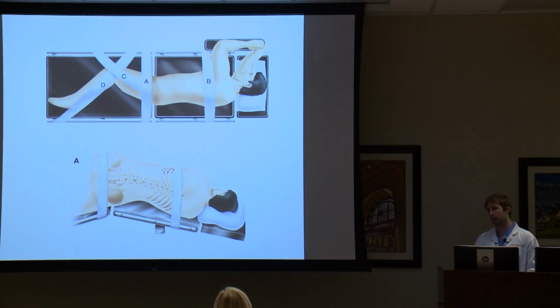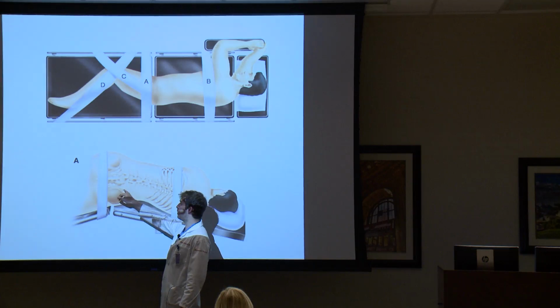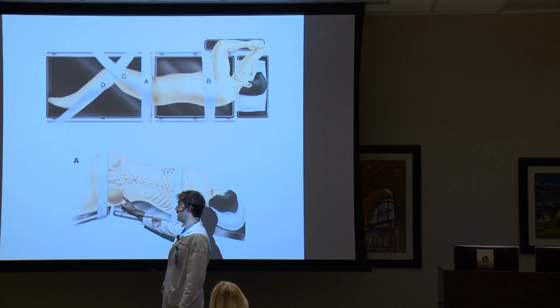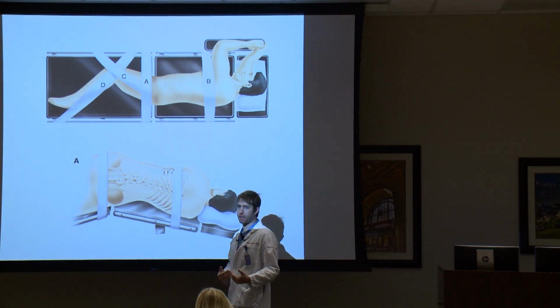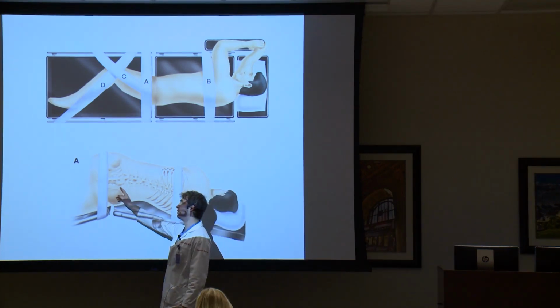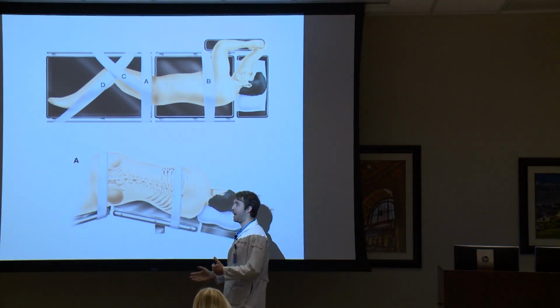We typically use the regular operative table in reverse. So you can break the bed right here, and you put their hip or their pelvic brim right on top right there, okay? And typically L4-5 is going to be right here where this stops. And so that automatically tells you that if someone's got a problem at L5-S1, you're not going to be able to get to it. You're just going to bang right into the bone. So usually we use L4-5 up for laterals.